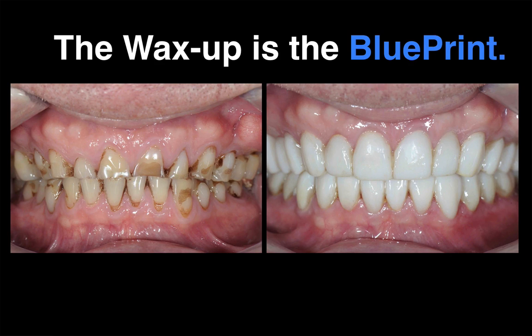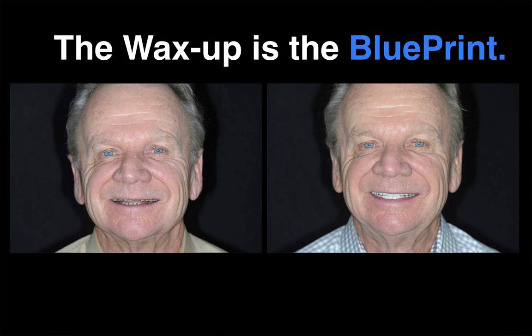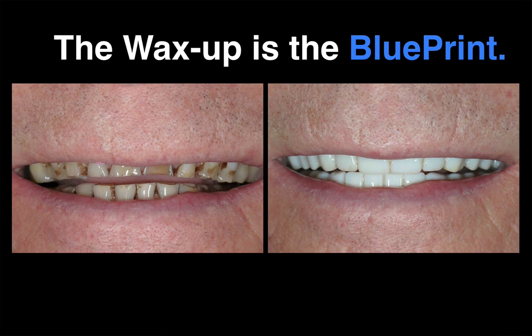So you look at the provisionals, we've changed the length of the teeth, we've changed the tooth volume, and we've changed the occlusion. We've opened the vertical, created some overjet and overbite, and maintained a pretty flat occlusal guidance scheme though, just because of his previous guidance scheme with the wear. And so look at the before and after change just by adding plastic additively in the mouth with the provisional restorations. So here he is with his provisional restorations.